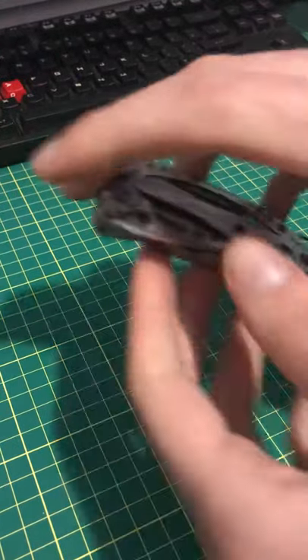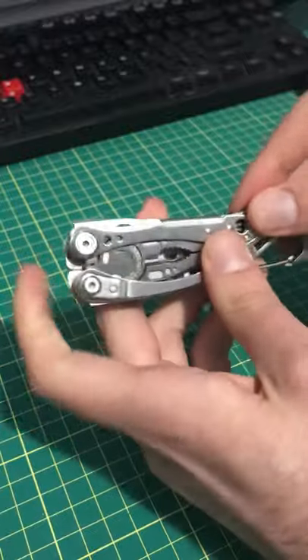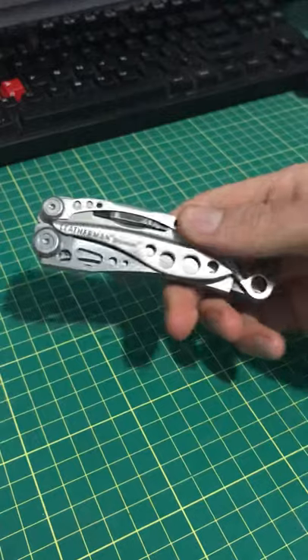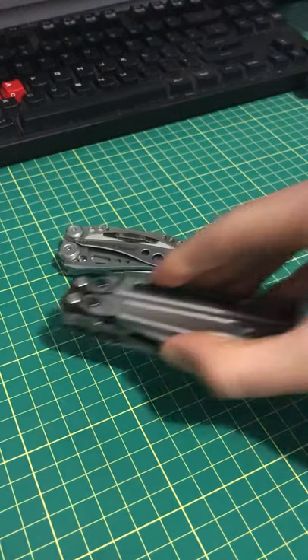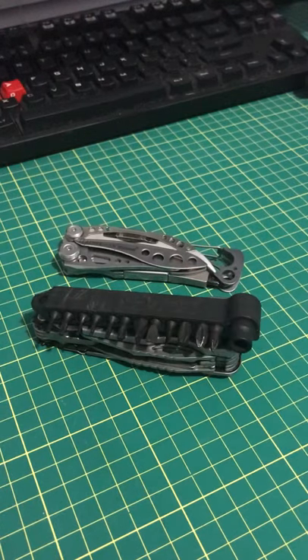So this is a multi-tool. It's multiple tools in one small package. It's just about the most practical, useful thing I own, and I carry it with me on a day-to-day basis. They come in a few different configurations, depending on the brand or the size of the model.